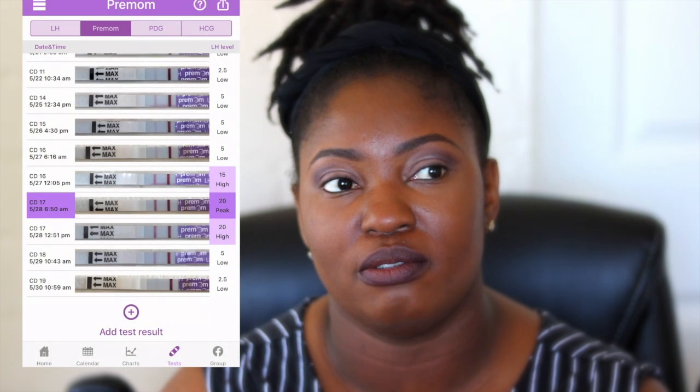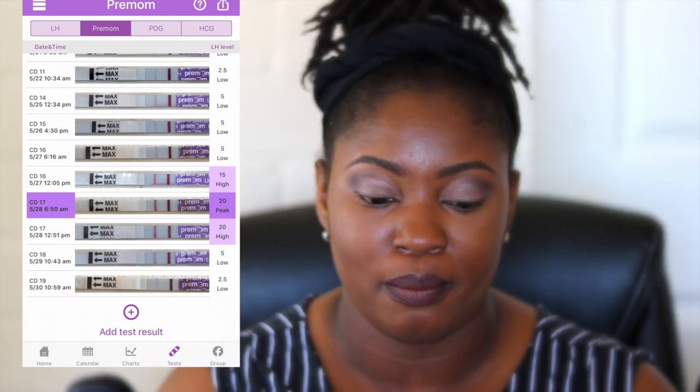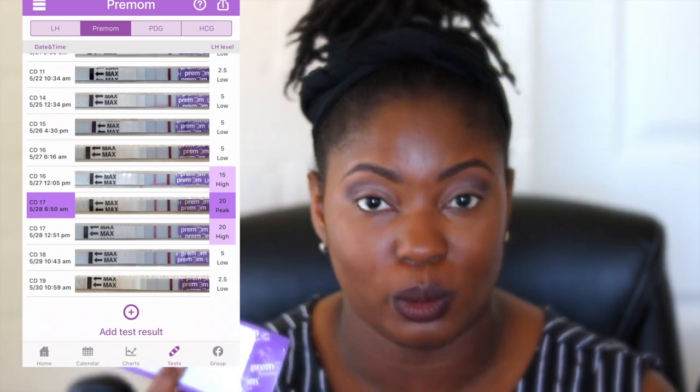I can show you with a screen recording of my chart, because you can input these into the Premom app as well. My peak was at 20 — sometimes it can be higher or lower than that — but by taking both types of tests together, my peak LH level and ovulation were definitely on the same day. It was so much easier with the semi-quantitative test to see my results.